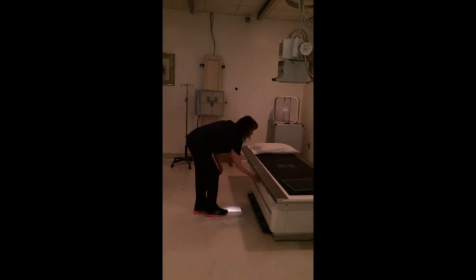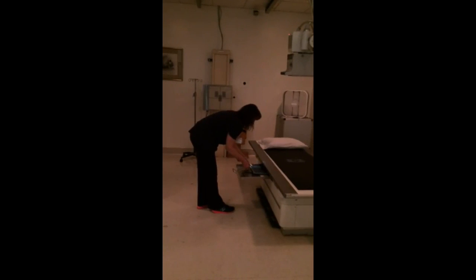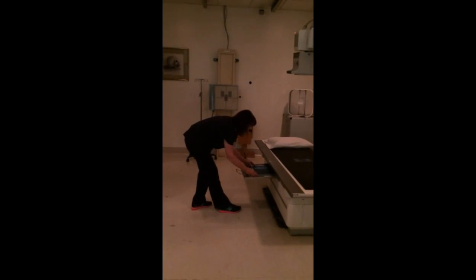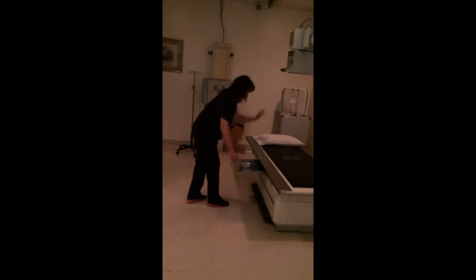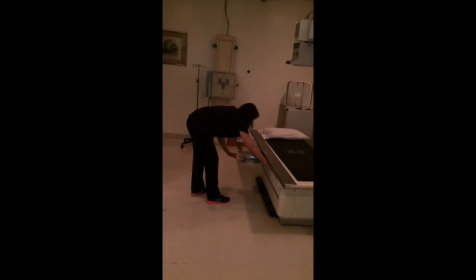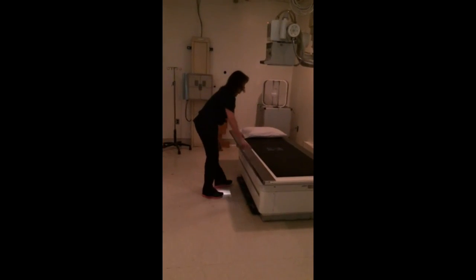Okay. Next, I am going to insert my cassette into the bucket, and line up my bucket. All right, now I'm ready to get my patient.